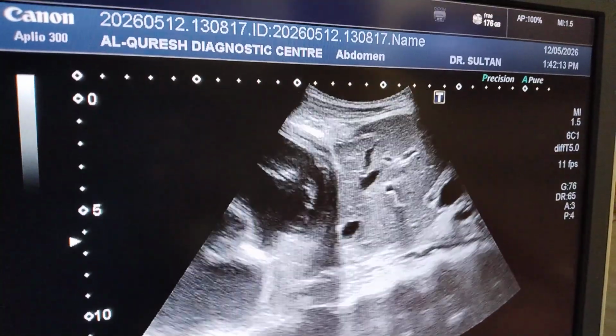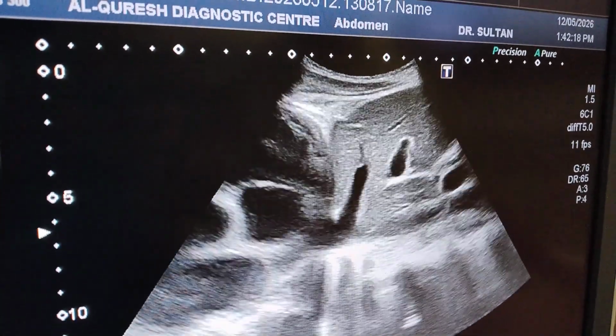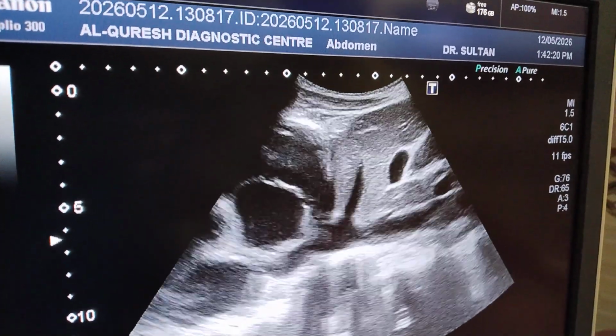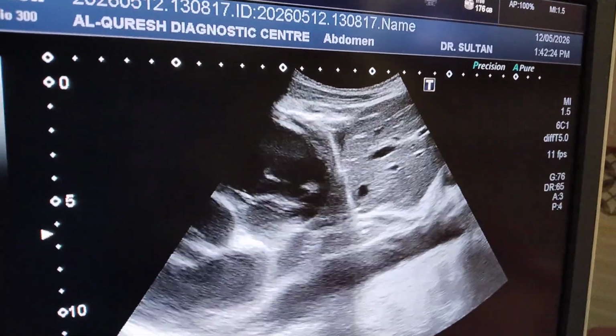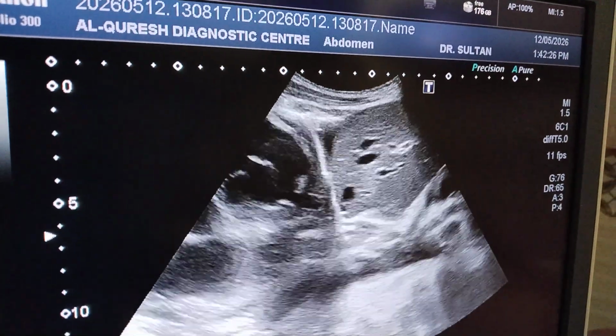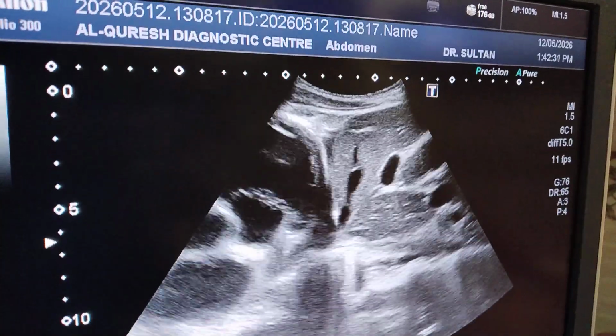So both we have seen that right heart chamber or right atrial pressure is increased with systemic venous congestion due to the findings of non-responsive dilated IVC, dilated hepatic veins.